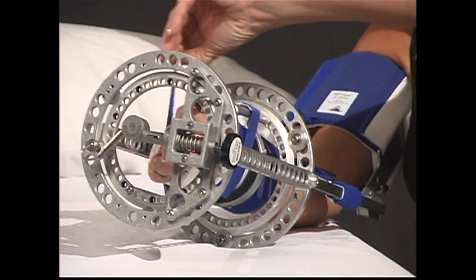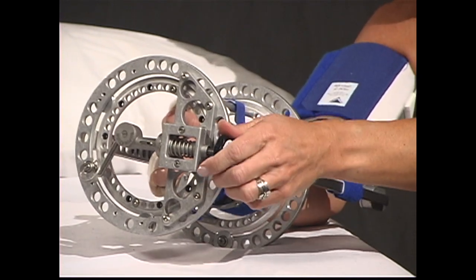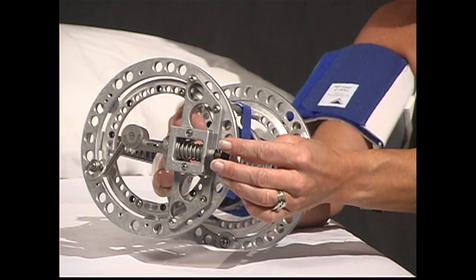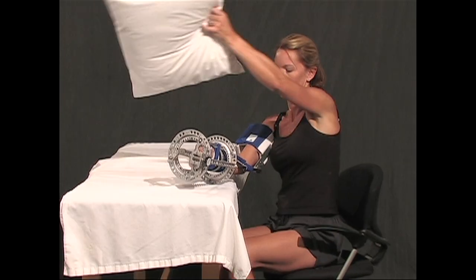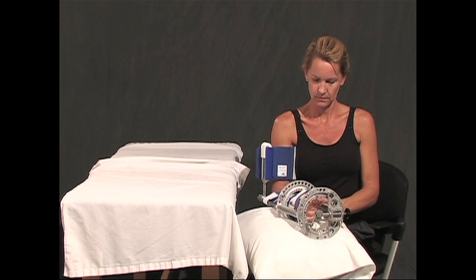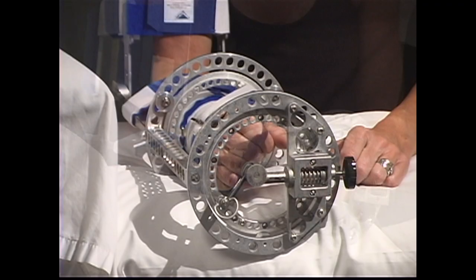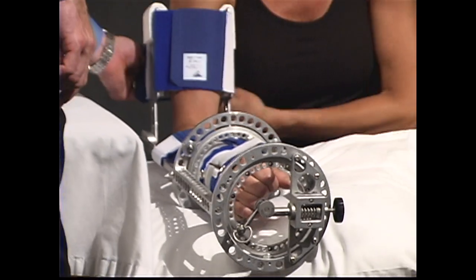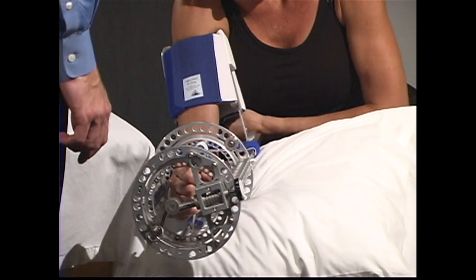After securing your hand in the Supination Pronation DynaSplint, increase the tension using the black knob and turning it counterclockwise.